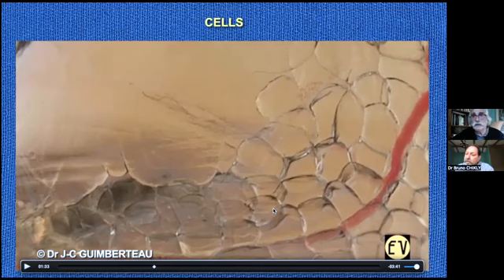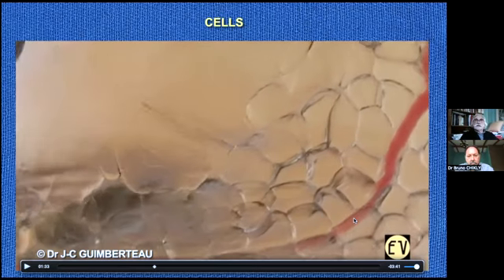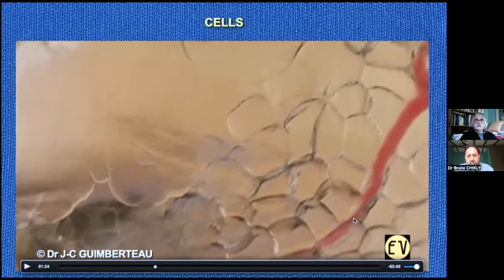You said fibrocyte. Here you have fibrocyte. But an adipocyte is more yellow. Okay, more yellow. And those are more transparent. Yes, here they are very transparent. So if you look at the cells here, they move.